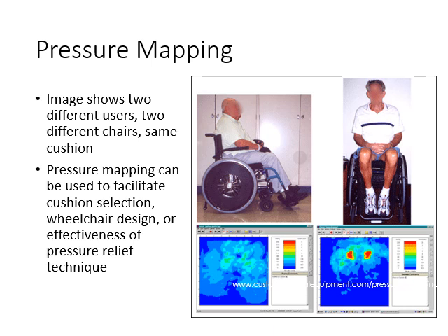Those are two pressure points for his ischial tuberosities. The gentleman on the left has a more even pressure distribution. The gentleman on the right also appears to have much longer thighs, so he has more pressure. His thighs aren't fully supported. So it's very important to have full support underneath the thighs to distribute the pressures away from bony areas.